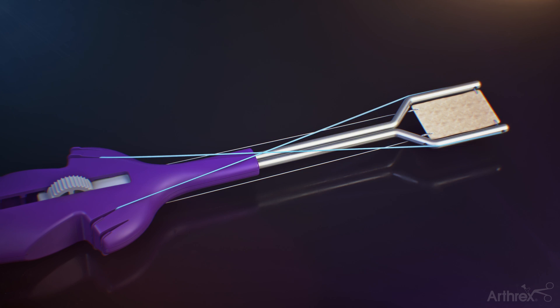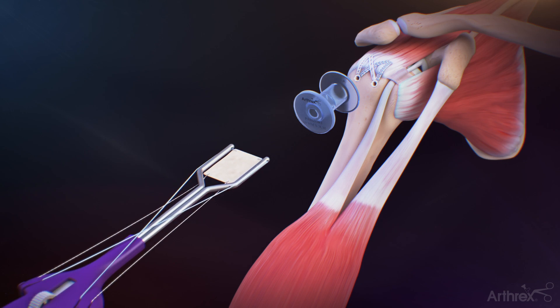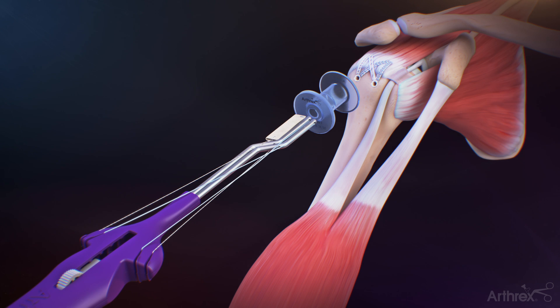Dock the lateral suture tape TigerLink sutures straight back into the outer cleats of the graft spreader. After loading the ArthroFlex graft onto the graft spreader, retract the arm by sliding the button in the direction away from the graft.